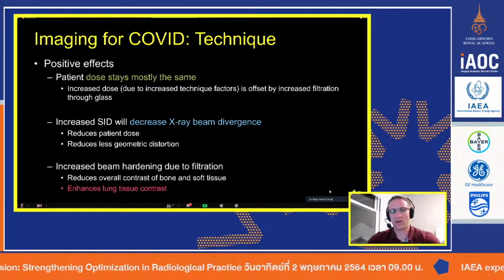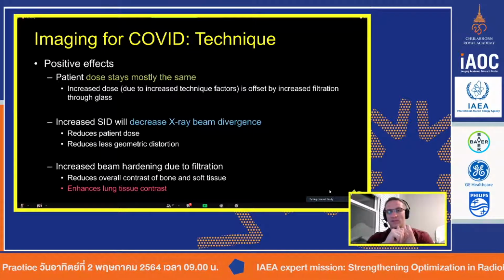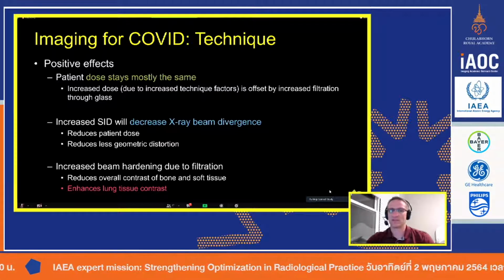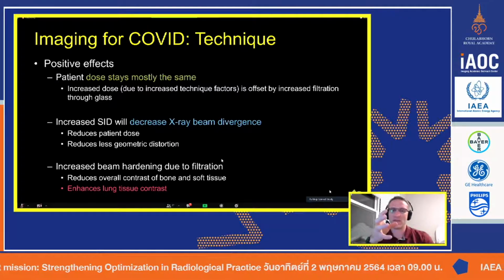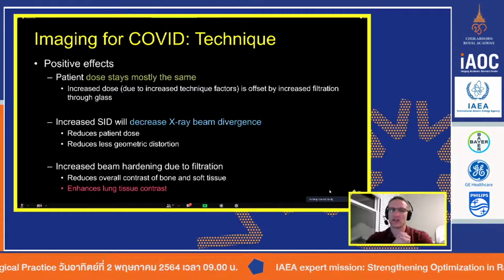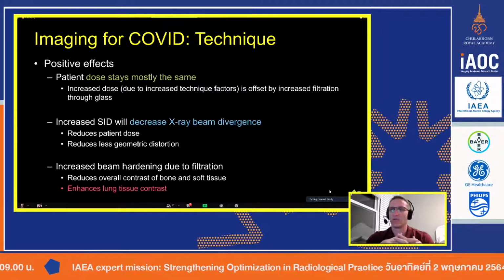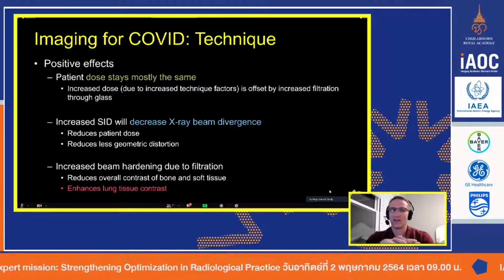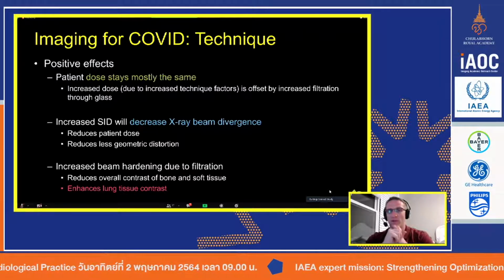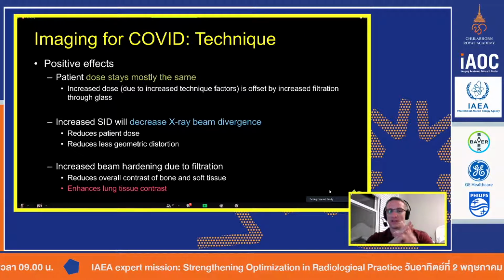So let's talk about how we've really talked a lot about the negatives here, right? We've talked about how we have to increase our kV to get through the glass. We've talked about extended SIDs, but there's actually some positives in this. First of all, we have to increase kV, but because we're imaging through glass, the glass is a filter. And so the dose to the patient actually hasn't changed that much as we've done the calculations. So don't worry too much, because yes, you've just doubled, maybe tripled your technique that you're normally used to. And that might be scary to some technologists. But understand that A, you're still doing this for their benefit, so even if it is a little more dose, that's okay. But two, most of that dose is getting absorbed in the glass, so it's not too bad.